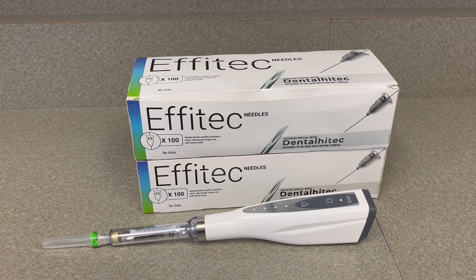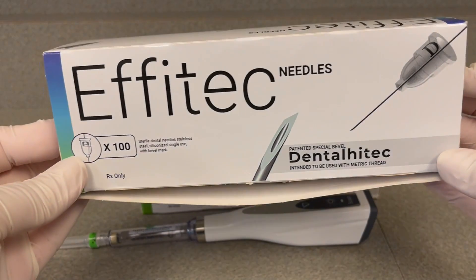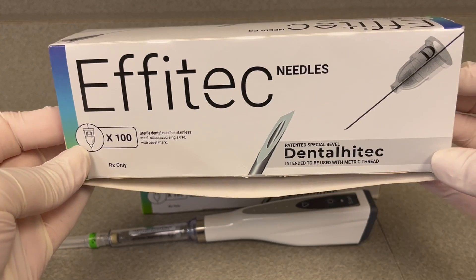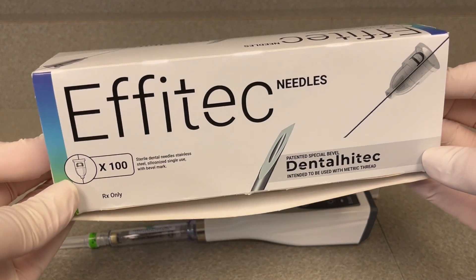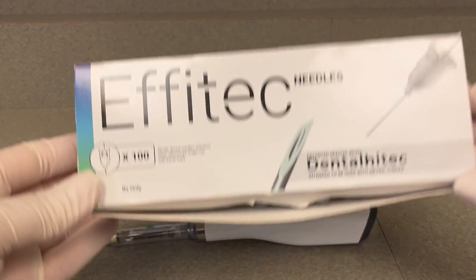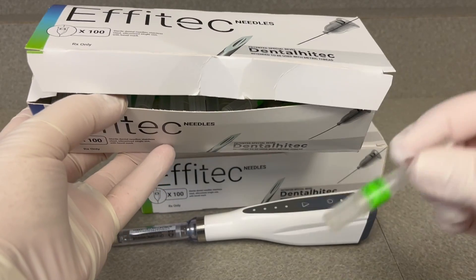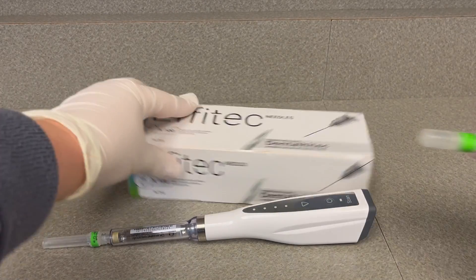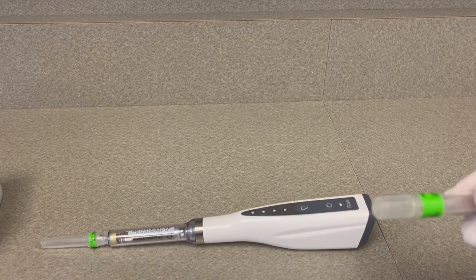These are the Effetec needles that are recommended to use with your device. They have the patented bevel needle that makes for a painless injection for the papilla or mucosa, and then allows you to penetrate bone in pediatric patients with primary teeth or mixed dentition. It's critically important that you use their proprietary needle. This is the green, the most common size that you'll use. I currently have two sizes: the green which is 9mm and the white which is 16mm.